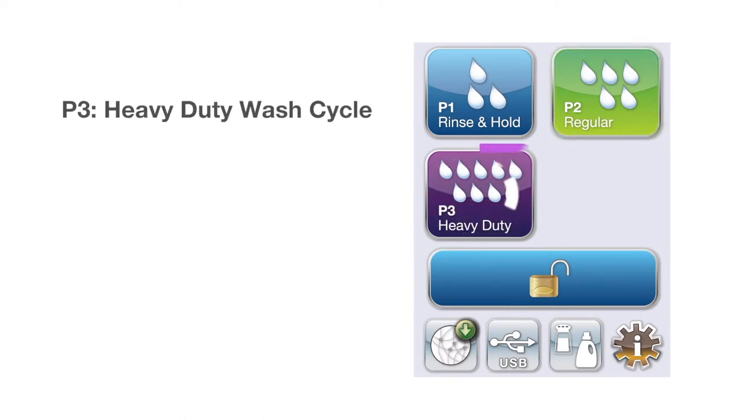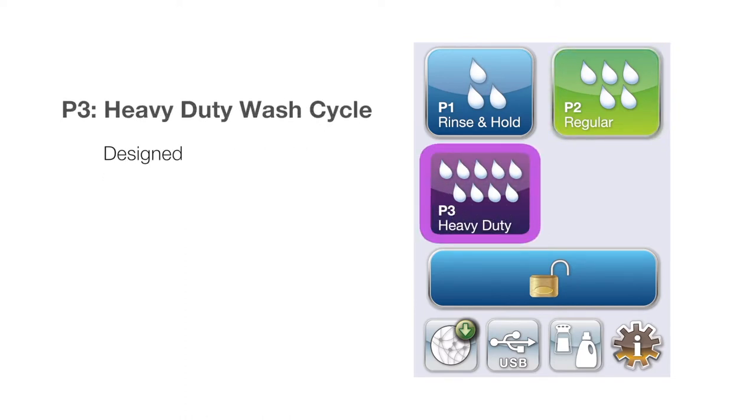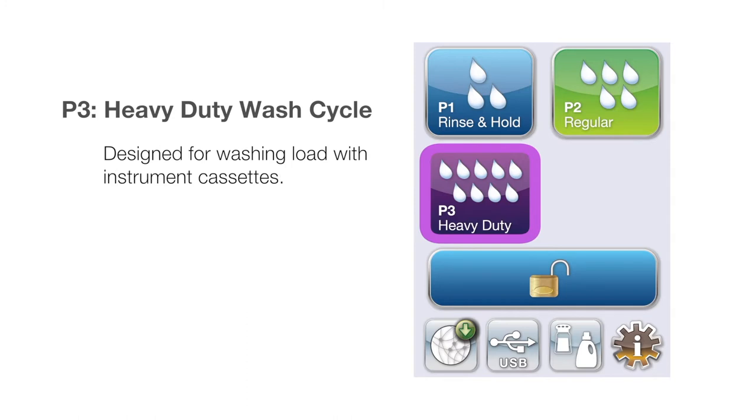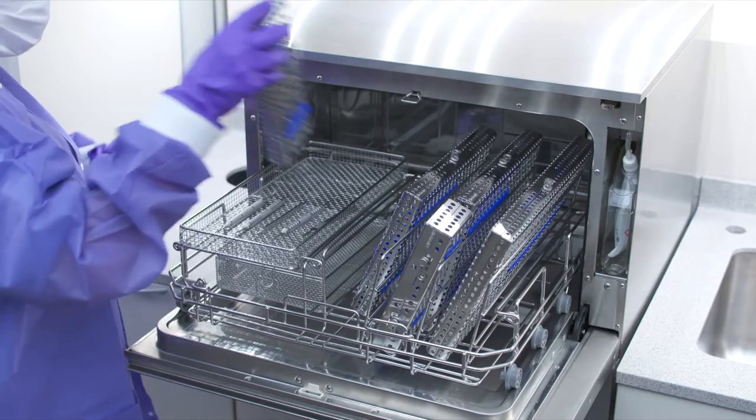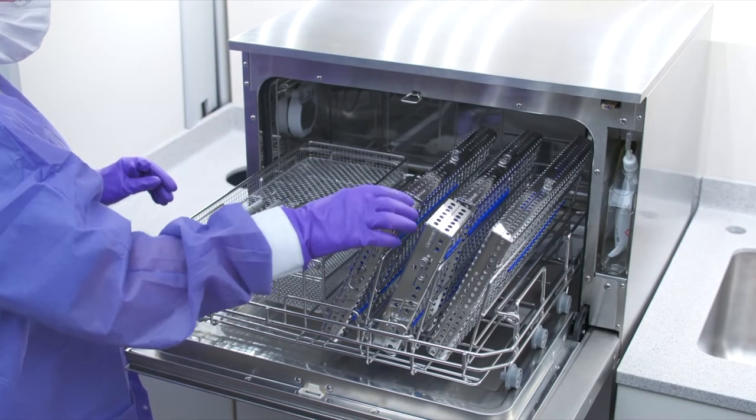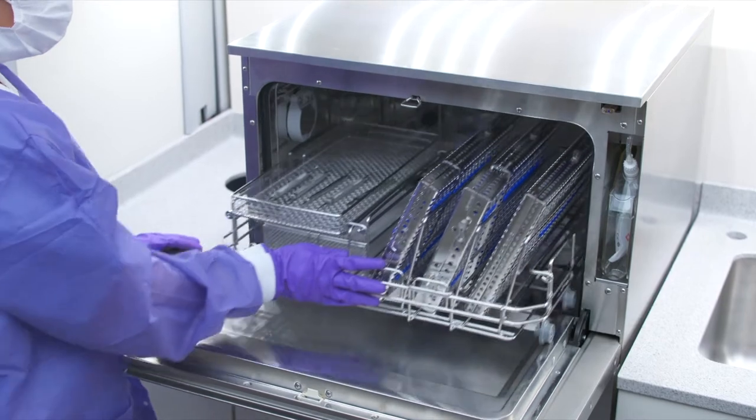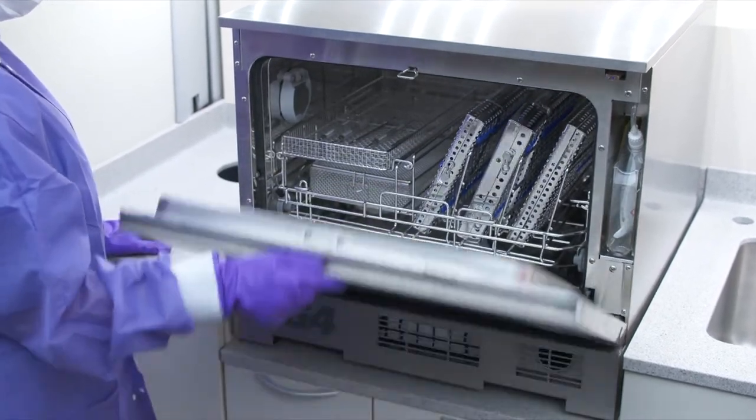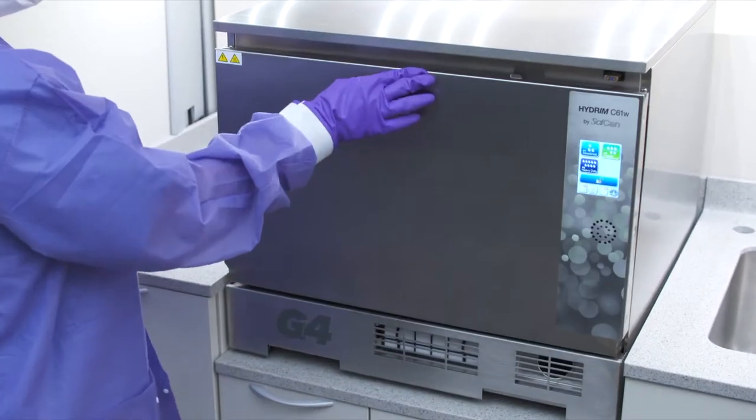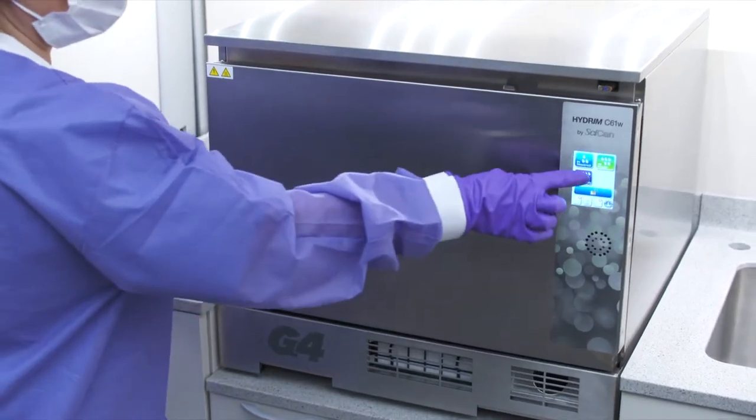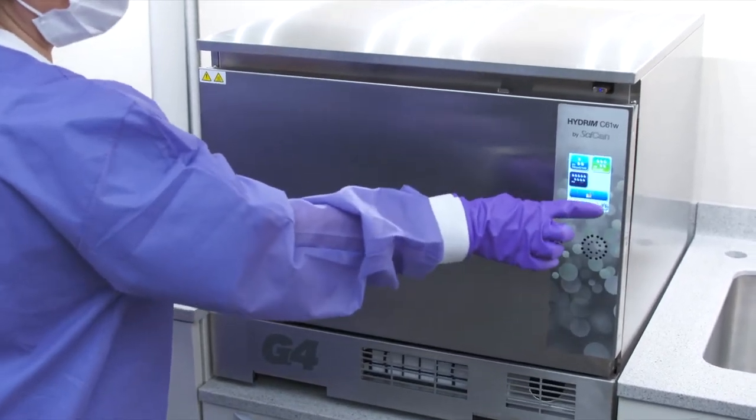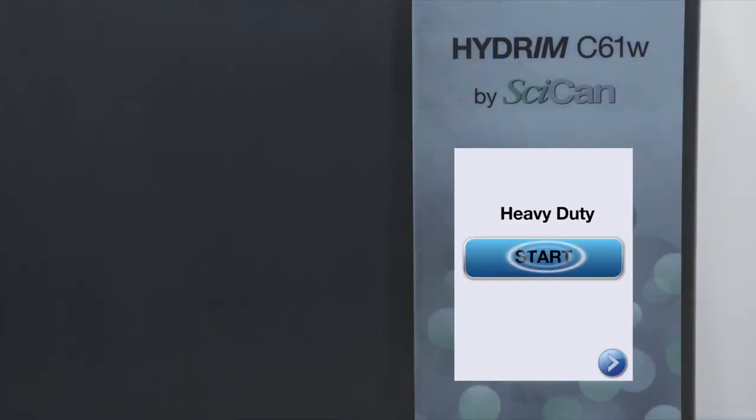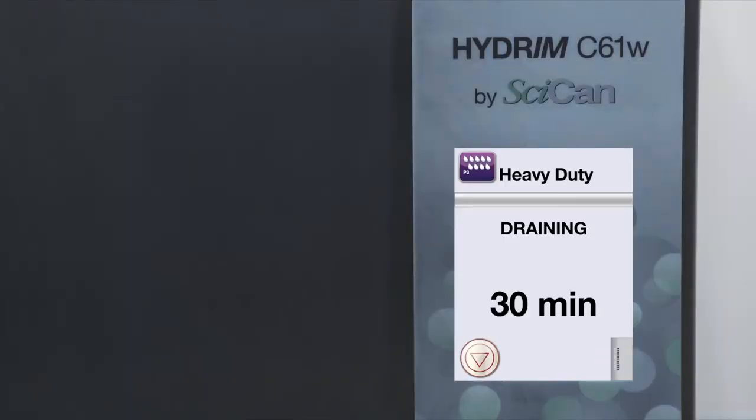P3 Heavy Duty Wash Cycle designed for washing load with instrument cassettes. For this type of full load, we will select P3 Heavy Duty Wash Cycle Program. Press the Start button to start the cycle. You will see the time it will take to finish the cleaning process.